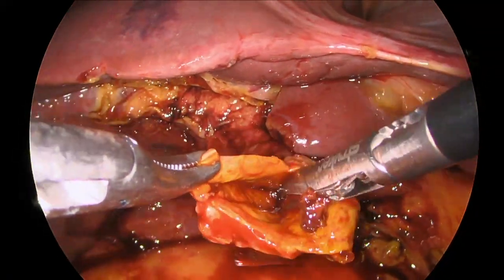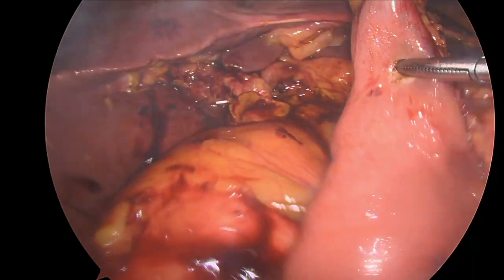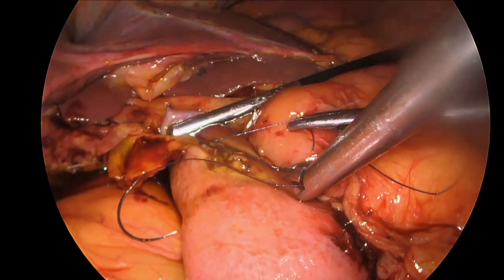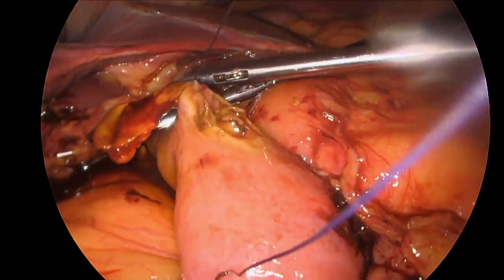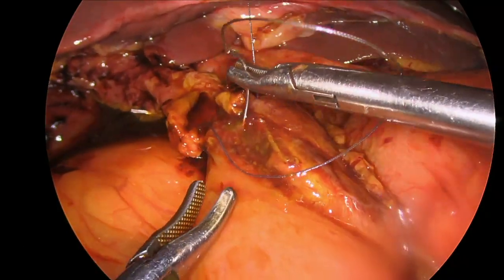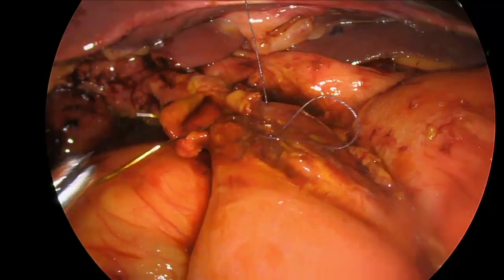This allows for a very wide anastomosis. The camera is then brought through a port in the right flank, allowing us a more optimal view for suturing. A hole is made in the small bowel for the bilioenteric reconstruction and a stay suture at the apex of the anastomosis is deployed. Using a running braided 4-0 suture, we do a running anastomosis of the back wall of the bowel to the bile duct as the first part of the duct mucosa anastomosis.